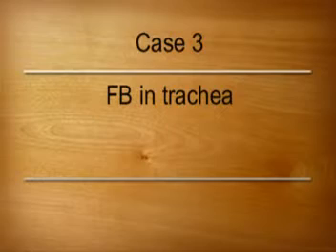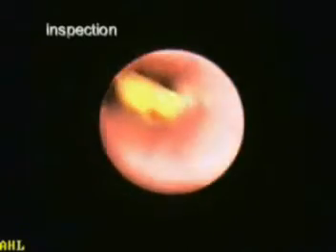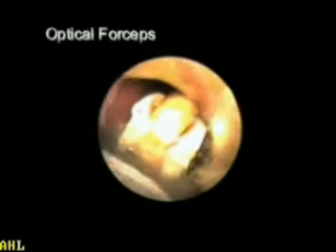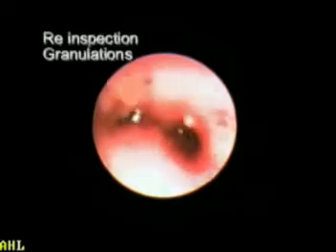Another case involves a foreign body in the trachea. A two-year-old child presents with respiratory distress and history of foreign body inhalation; X-ray showed right-sided emphysema. Bronchoscopy under general anesthesia revealed a ground nut in the lower trachea. Optical forceps are passed through the bronchoscope, the foreign body is grasped under vision, and removed along with the scope as one unit. Re-inspection revealed granulations at the site of impaction near the carina.